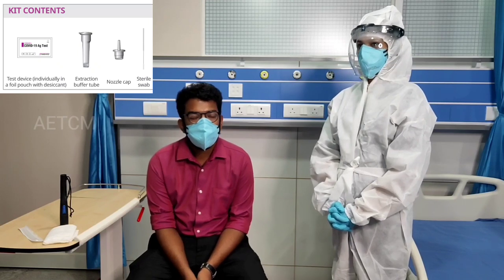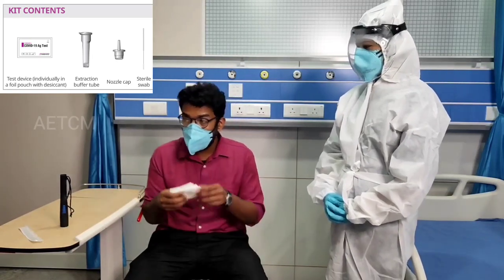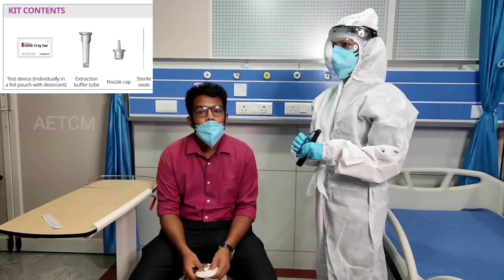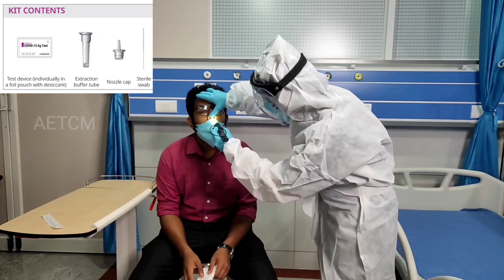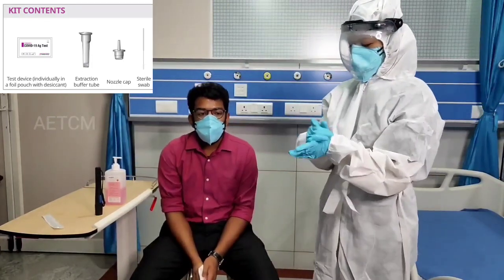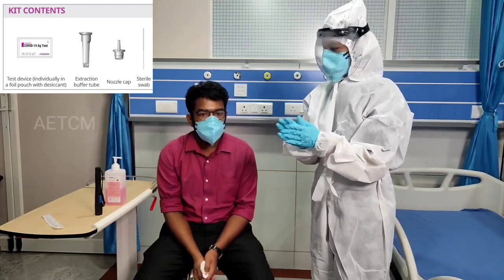Before starting the procedure, you have to explain to the person what exactly is going to be done, including the basic steps of the procedure, and also ask the person to clear his nostrils using a tissue paper. You should then examine both the nostrils and rule out any obvious nasal obstruction. Stand on the side of the patient while taking the swab, and also make sure you sanitize your hands over the gloves before taking the swab.